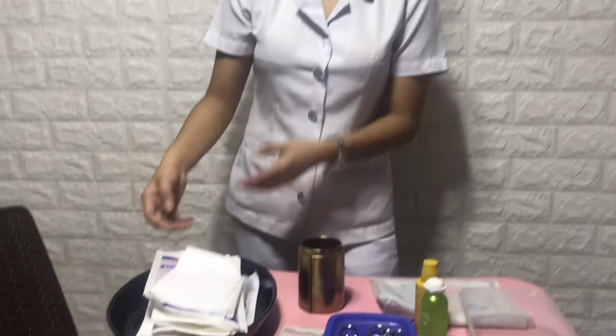And these are the materials which we will be inserting to the genital area of the female: the gloves, the syringe, the catheter itself, as well as the urinary bag. So these are all the materials that I will be using in this assessment. The rationale for this is that you can save time and effort since you already have the materials.